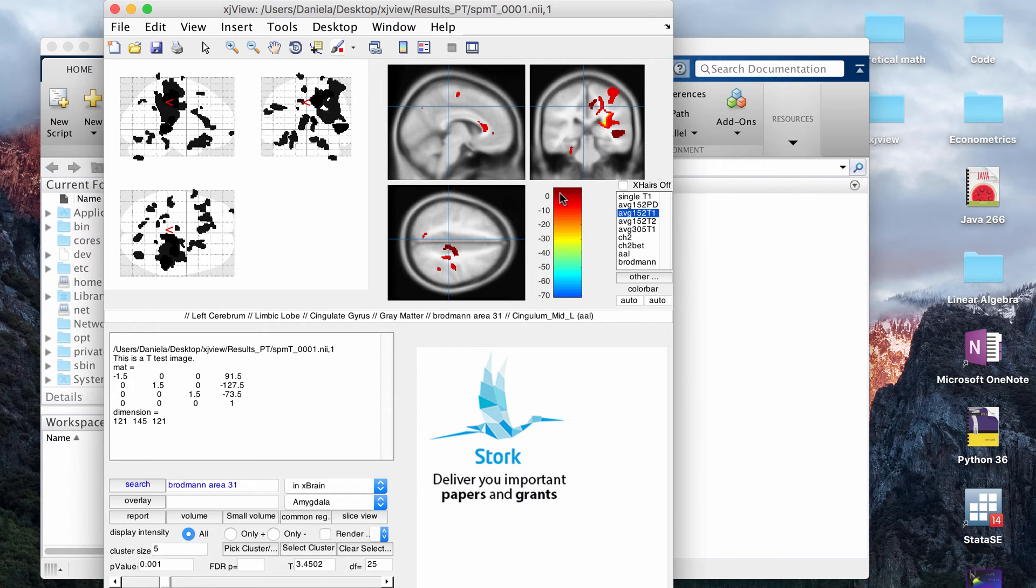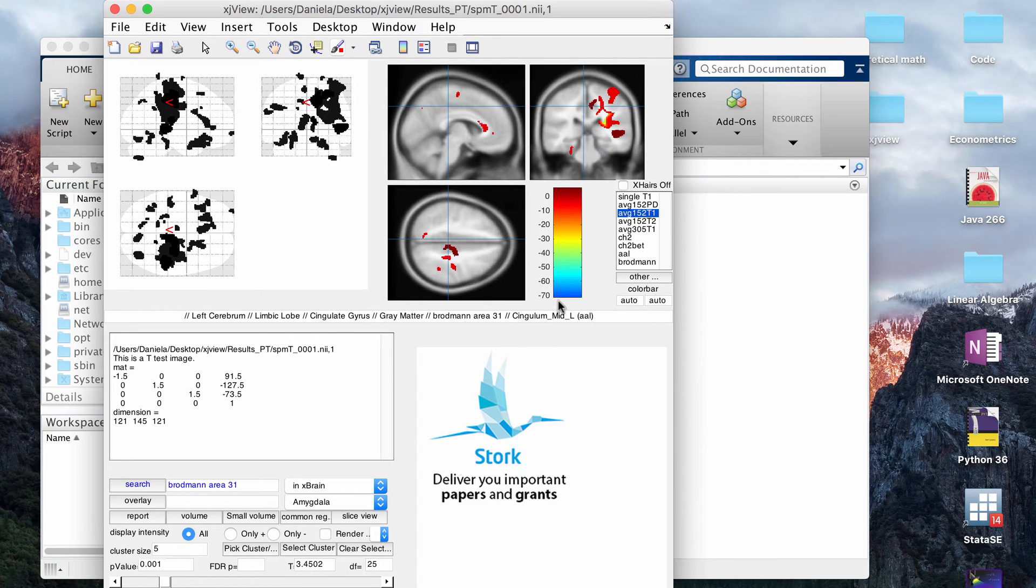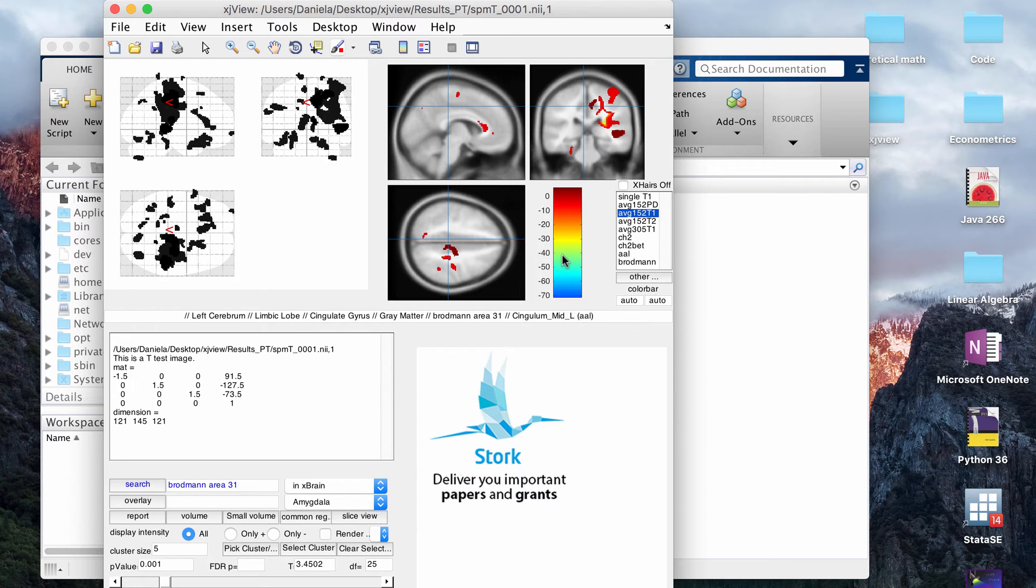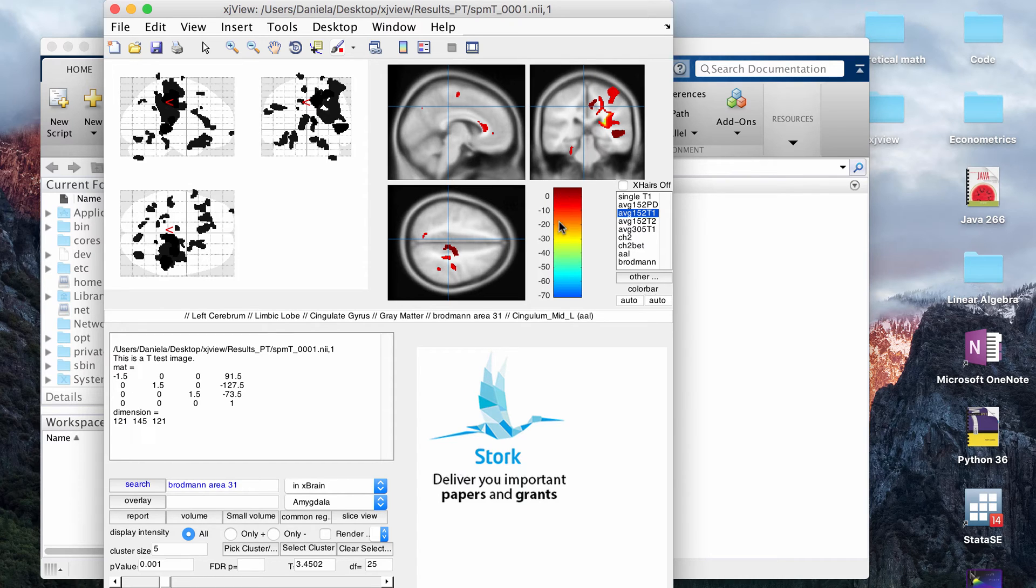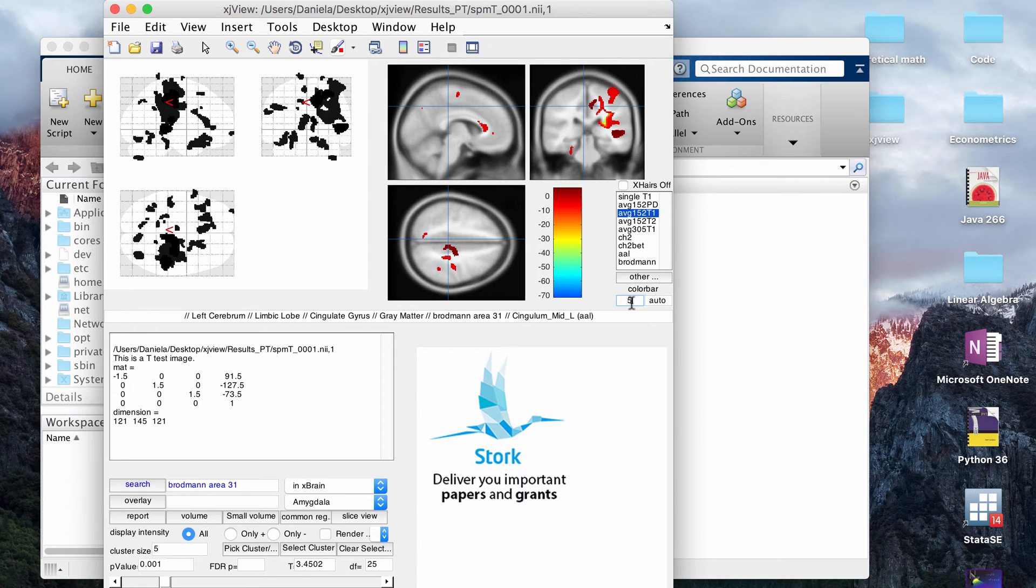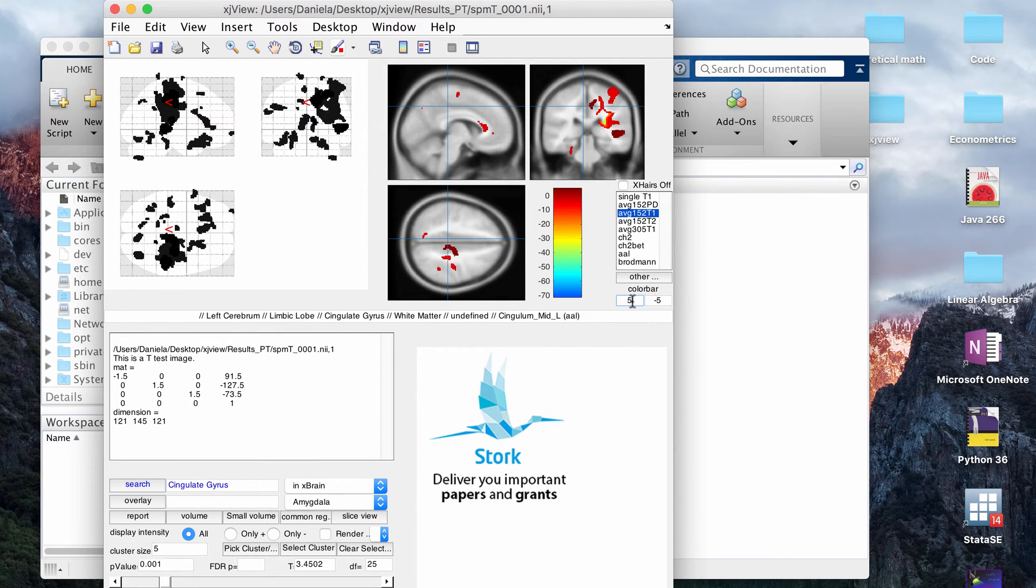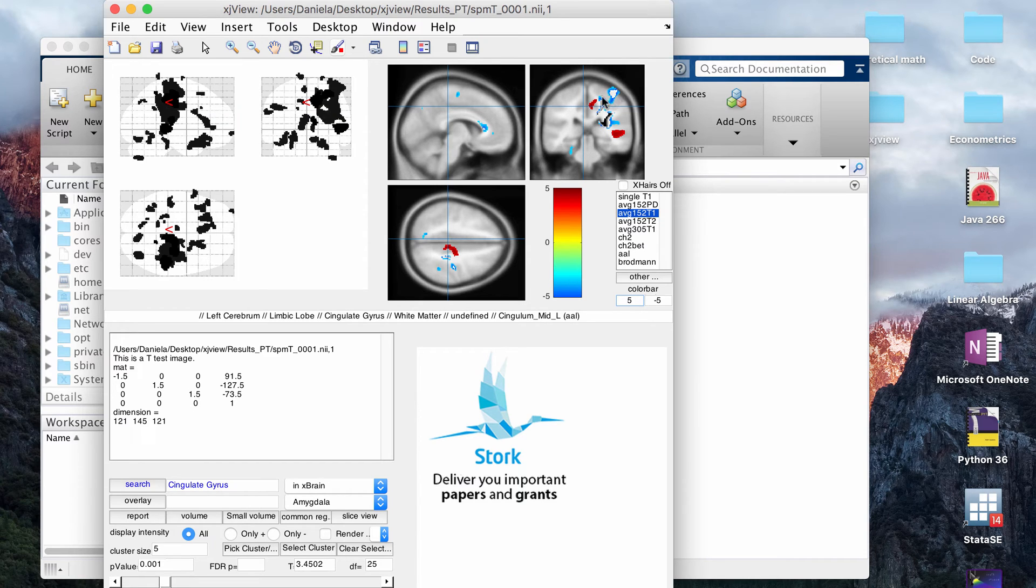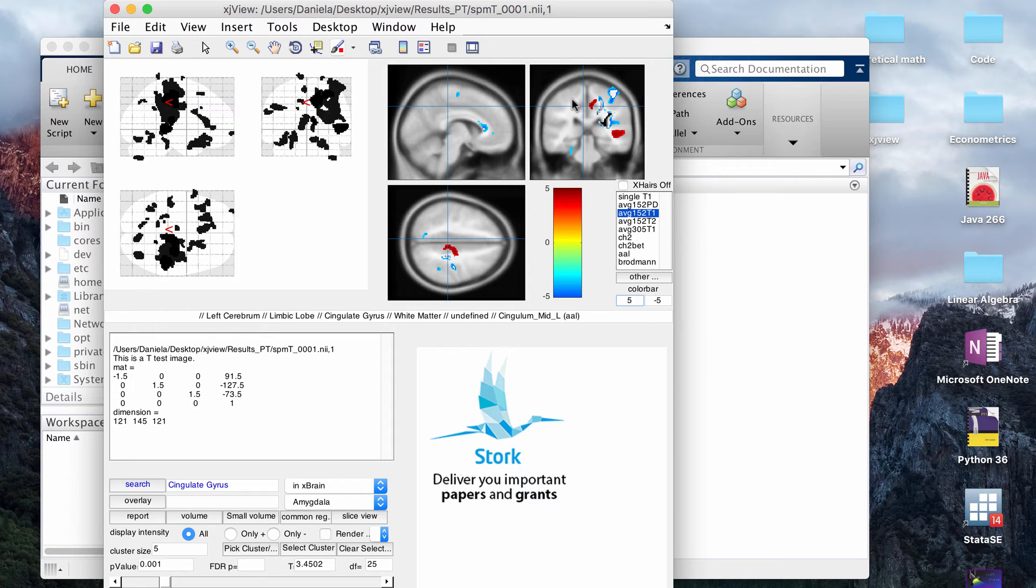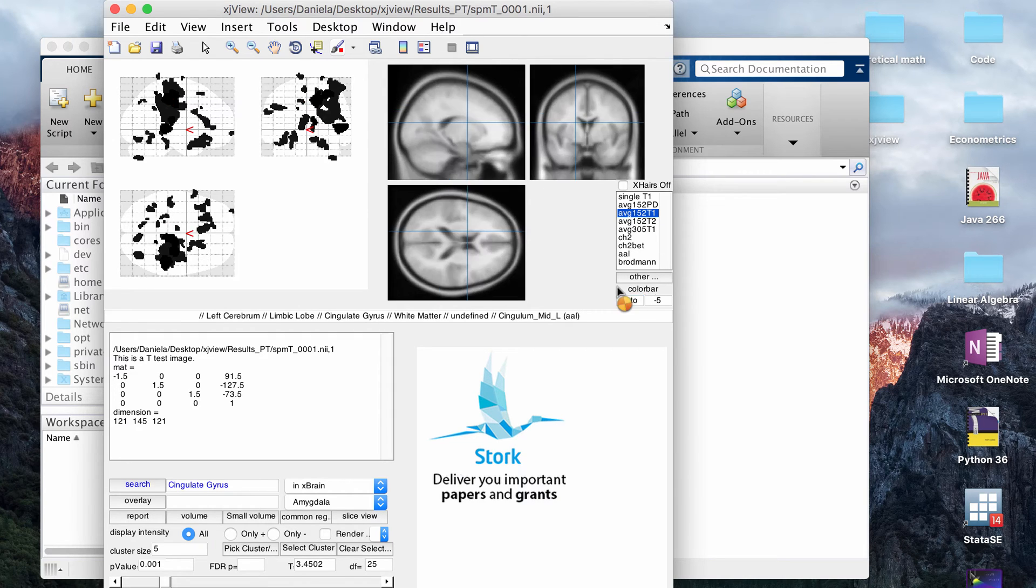I already checked these files before I started the video. It goes about from 5 to about negative 70, it says here, and this is what's auto-generated from the VBM results. If you wanted to look at a specific range, you can change the range here. If I wanted to look at from 5 to negative 5, for example, you type in those results here, and it looks a little bit weird obviously because you just cut out a lot of the lower values, but for some analyses that might be useful to you.